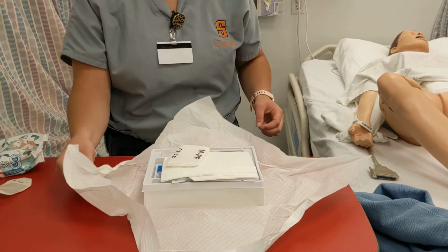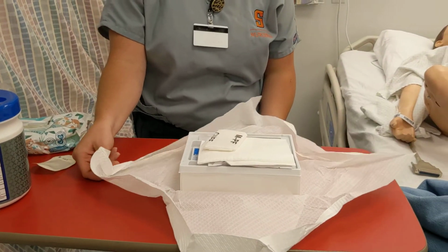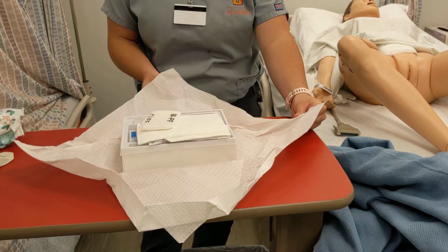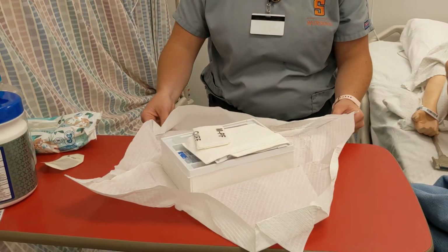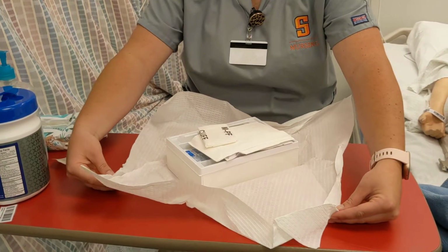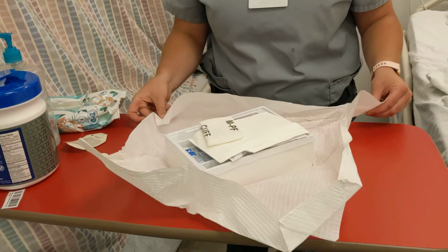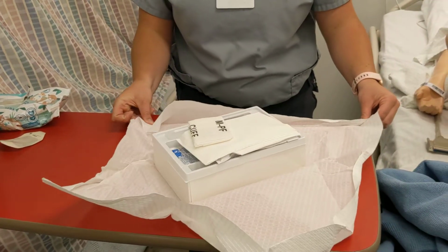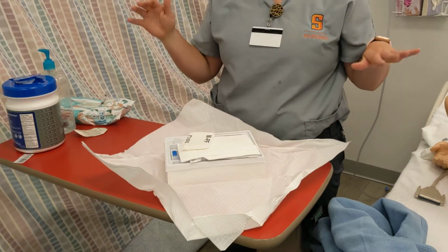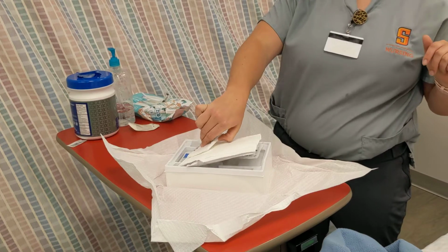Just observing that 1-inch line, making sure we're not contaminating anything. Okay, so I'm just gonna turn it so that I am not going to touch it. Okay, so I have not touched the inside. Everything is sterile still.